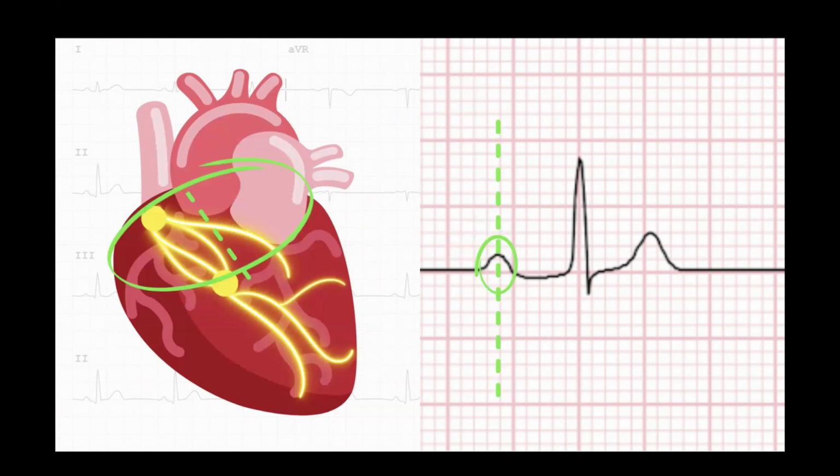And the atrial depolarization is what makes up your P wave, or the first positive inflection, right? This P wave is actually broken up into two parts, and that's the atrial septum right there. The first half is essentially the right atria depolarizing, the second half is left atria depolarizing.